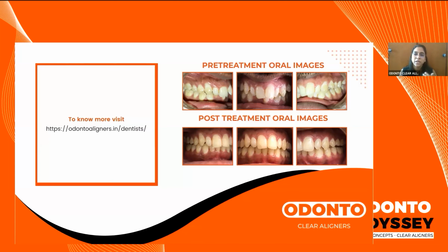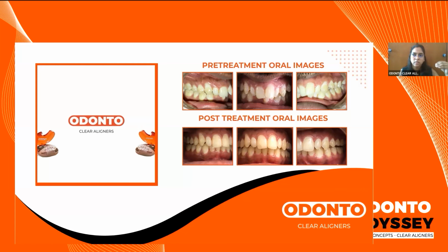So you will also have to explain to the patient that they might not immediately see results, though what we try to do is that as we are moving teeth at the back, we try to correct small mild rotations or uprighting of teeth, but we don't bring about major movements, and the patient will have to show some amount of patience in terms of achieving the anterior results. So that can happen, though we try to achieve anterior results first because that also leads to patient satisfaction. Otherwise, there can be patient fatigue, and if they don't see results anteriorly, they're not too satisfied with the treatment progress.